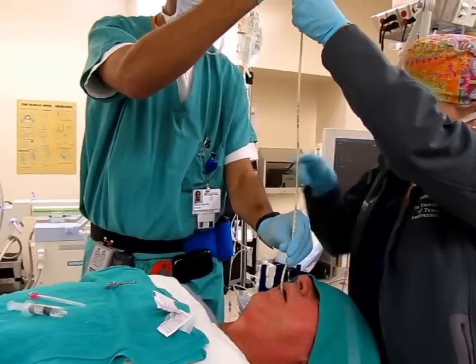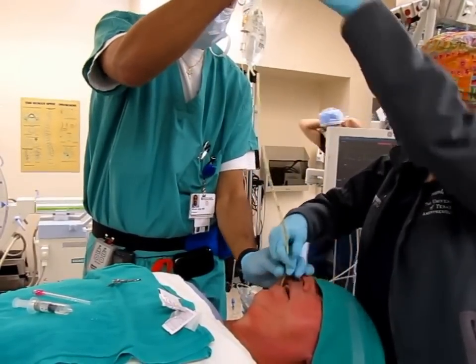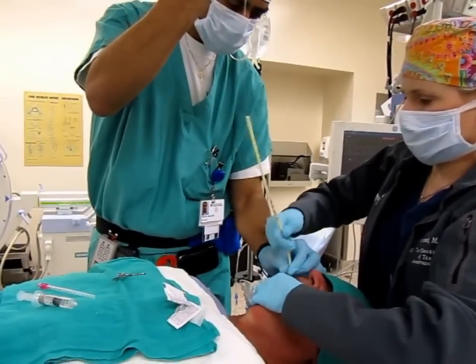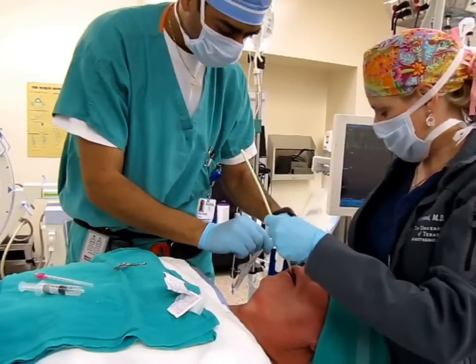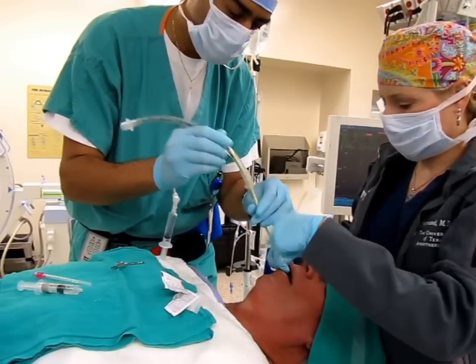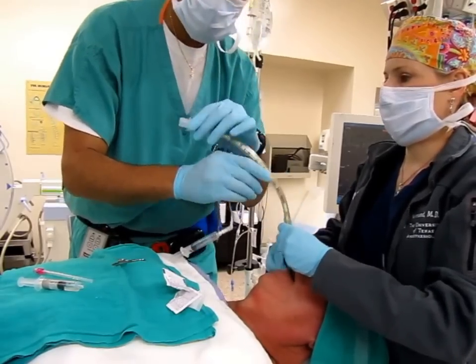Push it. Right when you get past, you've got to maintain tension on it. Put your cook catheter in. Take your guidewire out. You've got your ET tube right here — get your ET tube over it. If you have any resistance, you can put in the blade to look and see if it's in the right position.